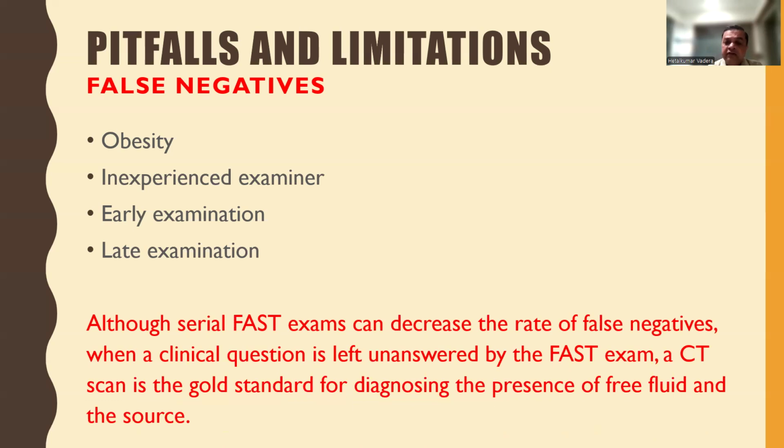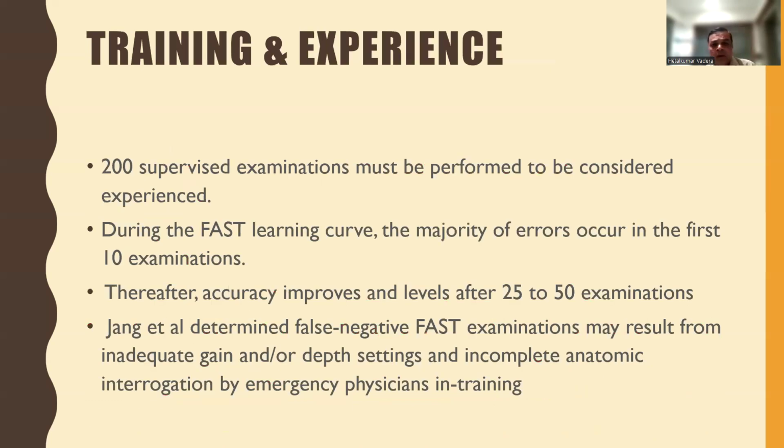So although serial FAST examination can decrease the rate of false negative, when a clinical question is left unanswered by the FAST exam, a CT scan is the gold standard for diagnosing the presence of free fluid in the abdomen. So don't always rule out CT scan. Once the patient is stable, go for the CT scan for final diagnosis.